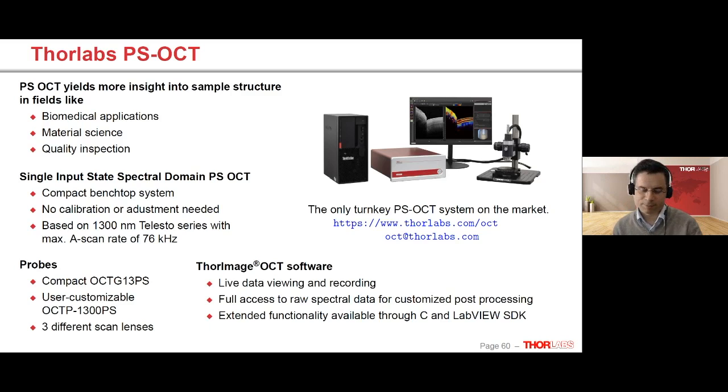The Stokes parameters have the advantage that you don't have to think of the phase. The Jones vectors, well, I don't know of a display to put them in pictures, but they're available, so it's very easy to compute them from the raw signals, or using our SDK. You can get them also.